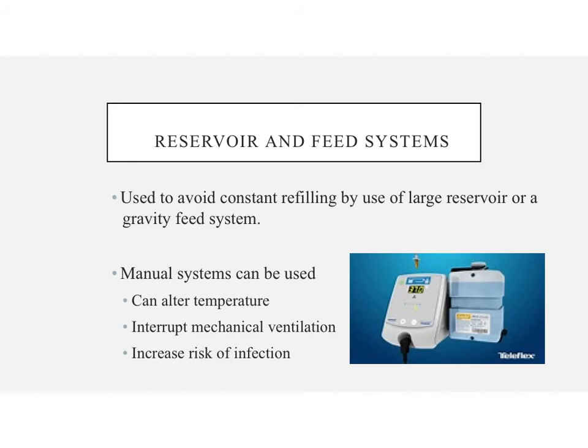When we do that, we can increase the risk of infection to the patient, not only from disconnecting the ventilator, but because even if we're adding sterile water, we are exposing the reservoir of that humidifier to the open air and pathogens.